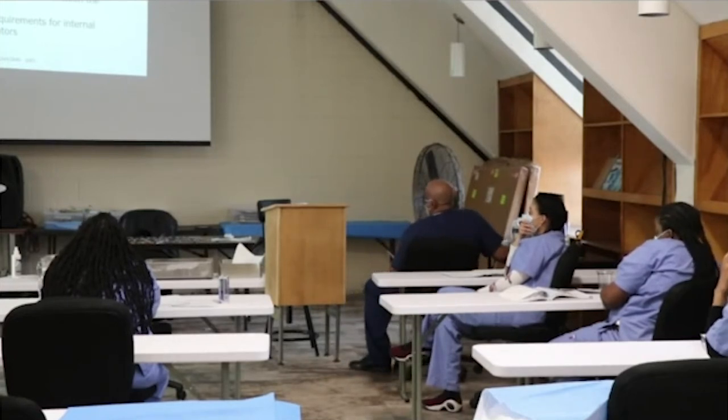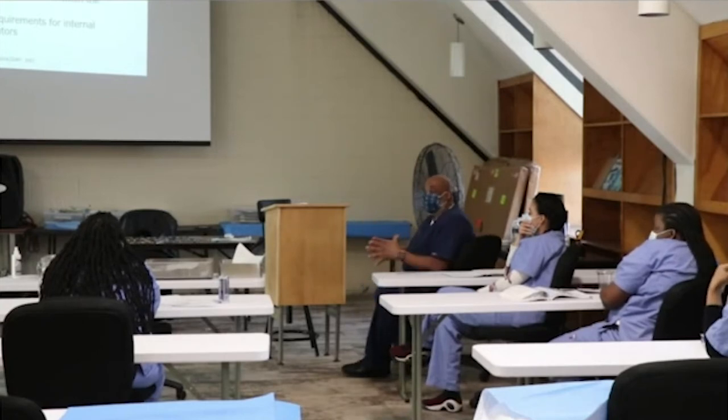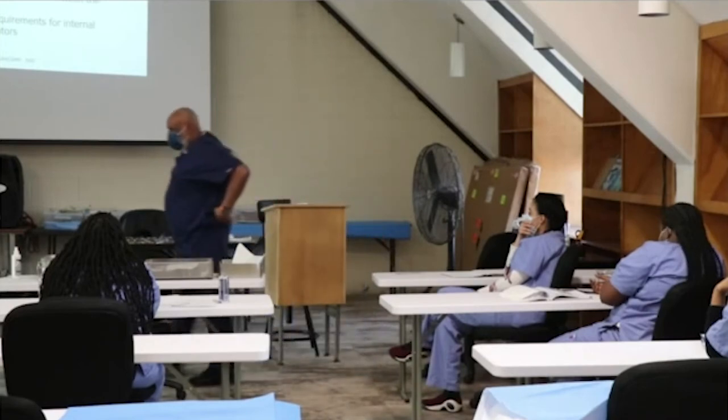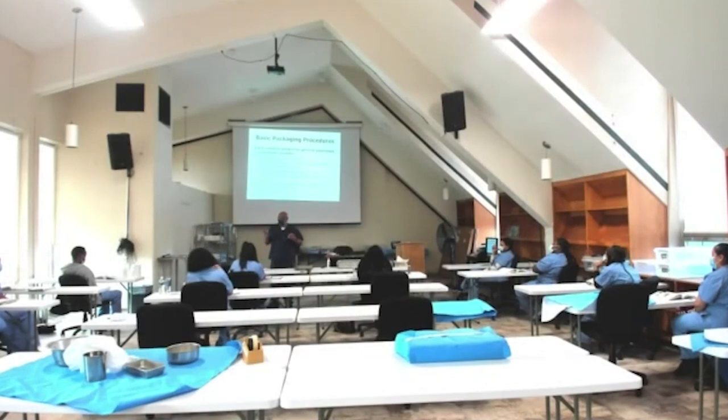We want to make sure the type and size, you guys demonstrated this so well today with the peel packs and the wrap. We always want to be size appropriate with what we are trying to wrap and the method. The other thing that we looked at, when we were looking at single instruments, so this arthroscopy shaver, they double peel packed it, which is a no-no. How would you do it, Terrell? Would you peel pack it? Okay, how else would you do it?